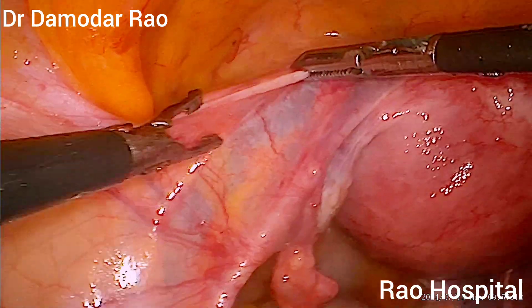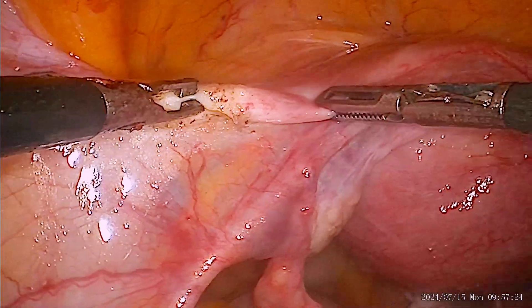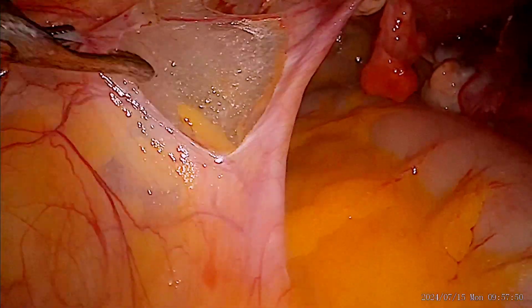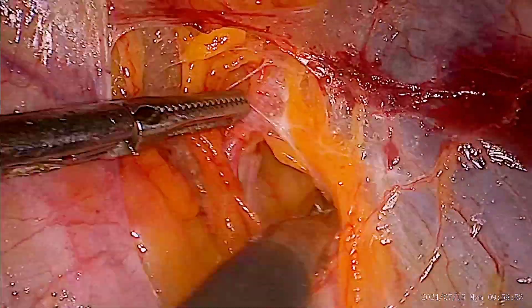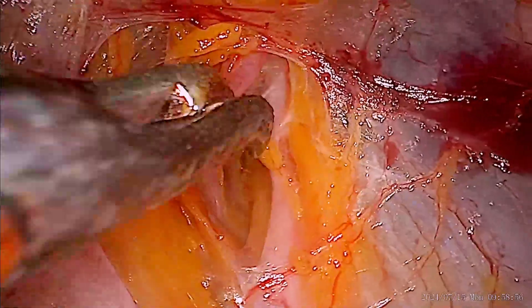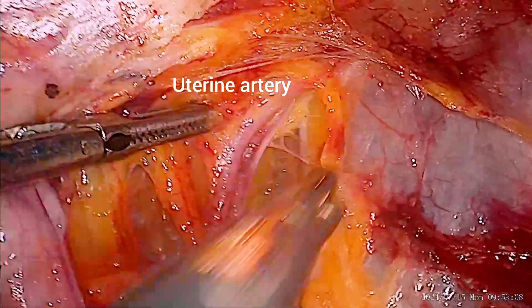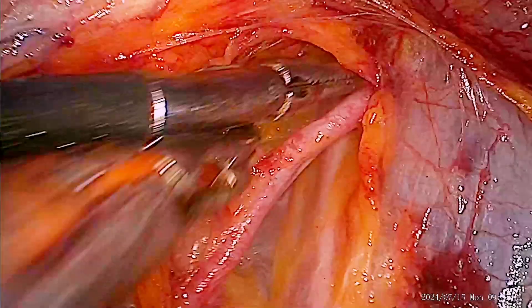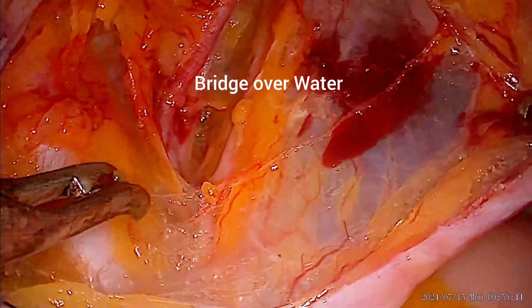Hi friends, this is a small snippet to show you the lateral avascular spaces that contain all the important arteries and vessels. This is a lateral vascular space. The first structure to be seen is a ureter. If you go lateral and parallel to the ureter, you will come across a structure that traverses from lateral to medial, and that is the uterine artery — the classical textbook 'bridge over water.'